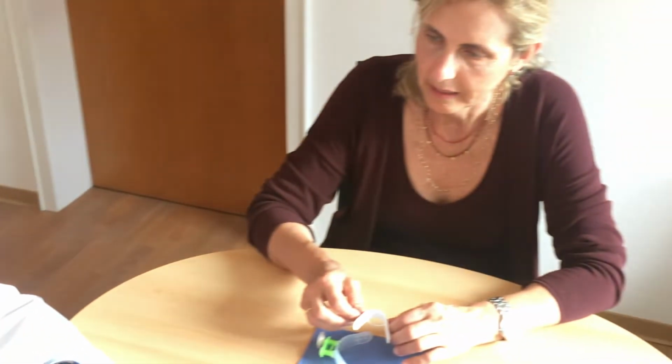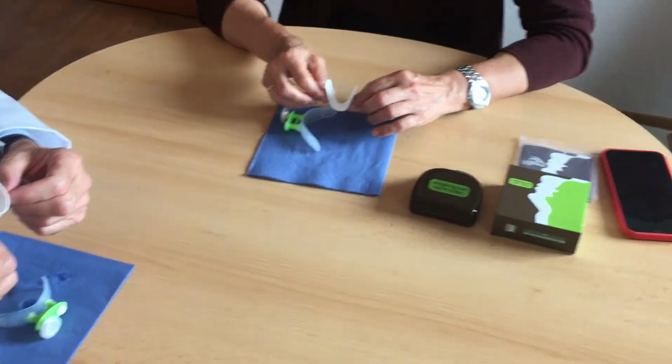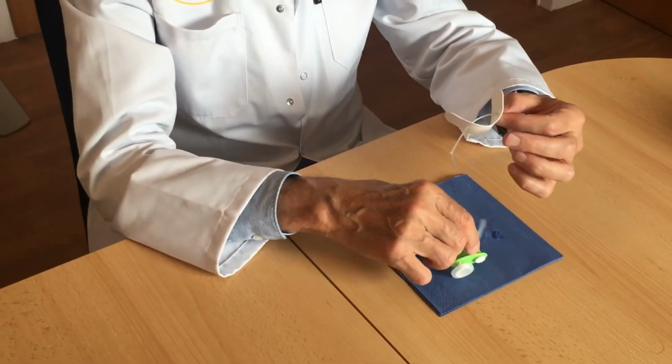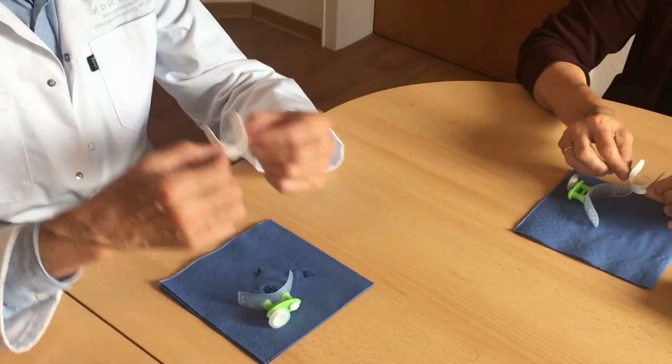I will show you how we use this device. We place it in the same manner as the vacuum activator, and we repeat the swallowing.